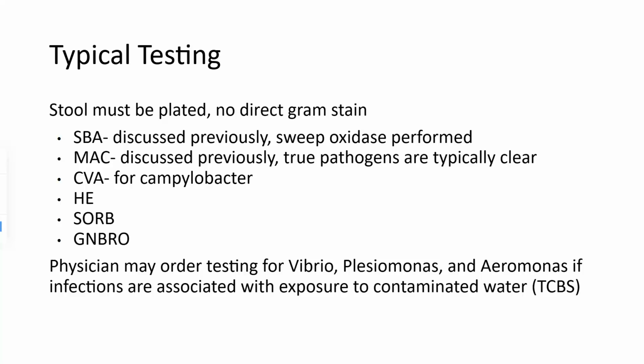Also, even if you try to do a direct examination for parasites and such, parasites look a lot like partially digested food or whatever type of digested roughage is left in the stool from the sample. So even if we're going to look at stool for parasites, we would have to do a number of concentration procedures to be able to try to isolate those parasitic forms. So stool, we typically do not look at that directly under the microscope. We're going to plate it to try to see what we have.